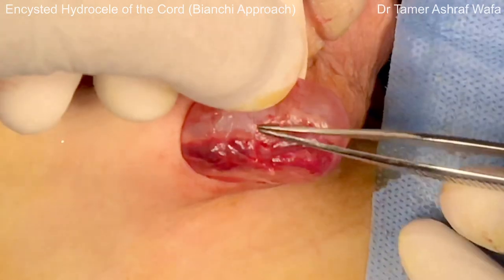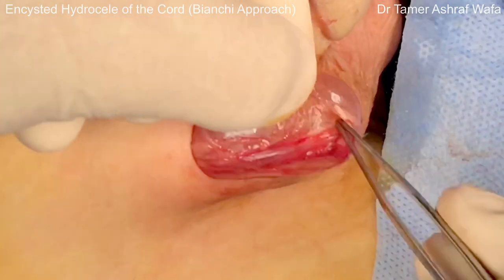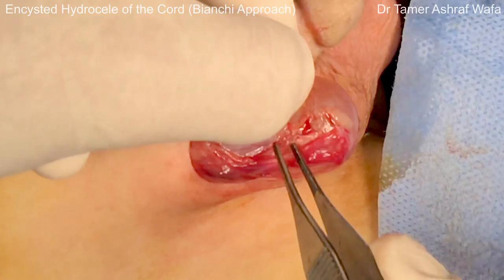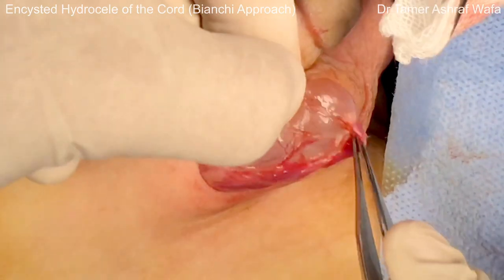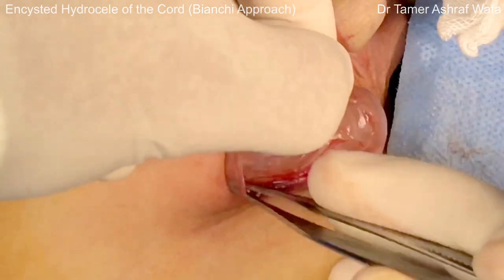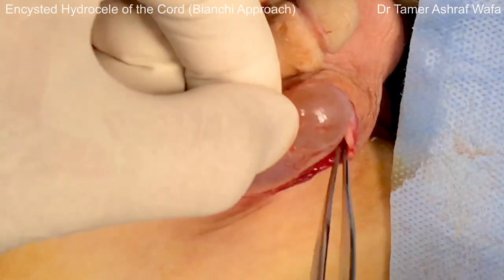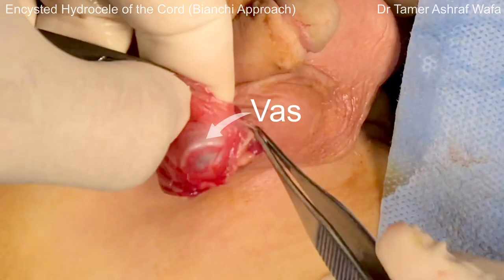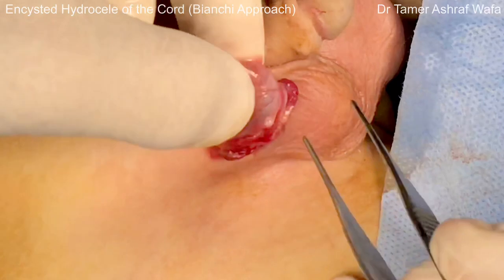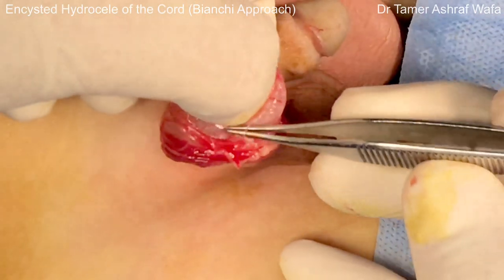Now the vas and vessels are dissected bluntly using an un-toothed forceps. First, the vessels are gently swiped off the sac until the vas comes in view. Then the vas is gently swiped off the sac until it is fully separated.